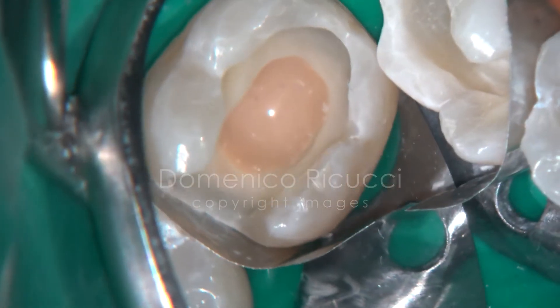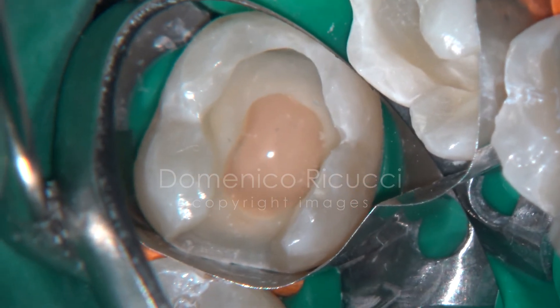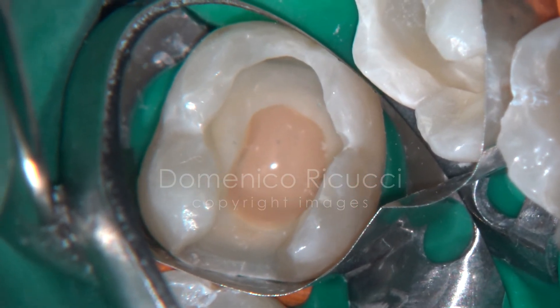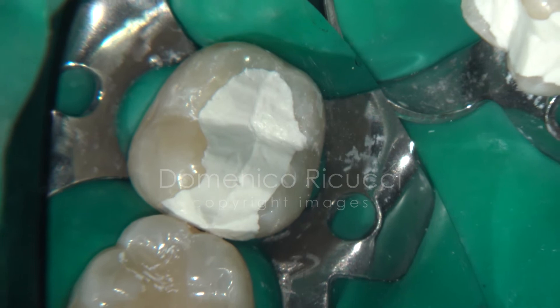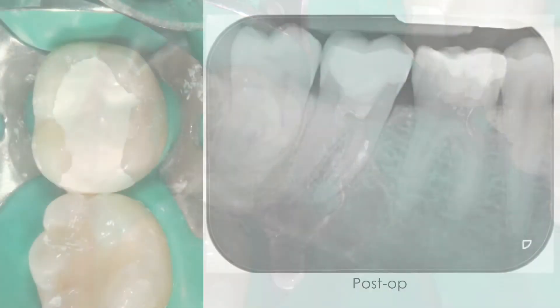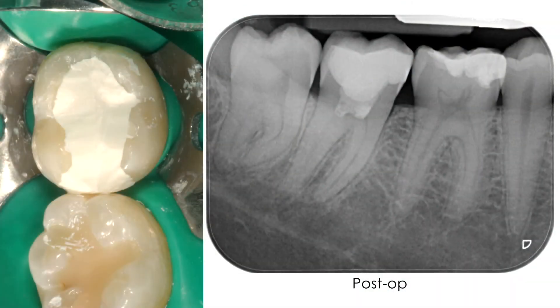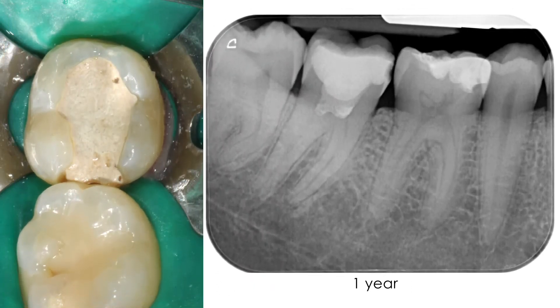The bioceramic material is covered with Dical and the cavity temporarily restored with IRM. A postoperative radiograph is taken.